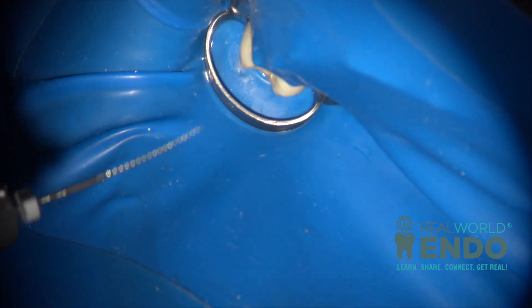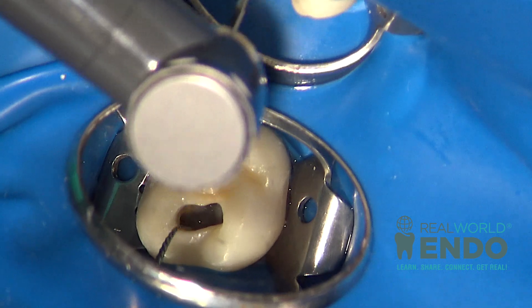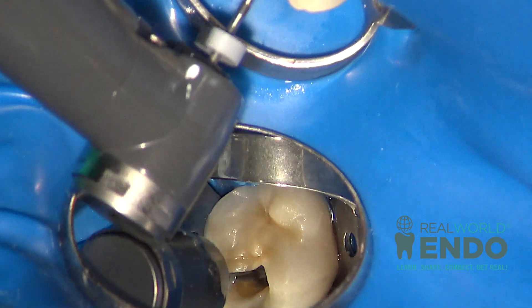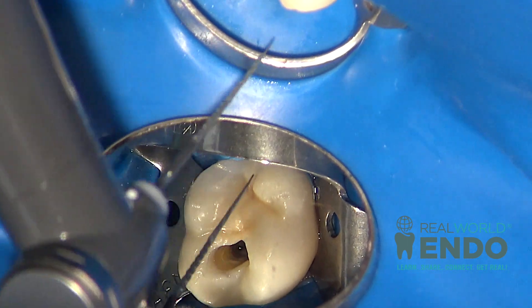The limitation is because of the heat present in your hand as you're doing it, or even the room temperature. But if you actually take an alcohol gauze and bend the file with it, as the alcohol evaporates from the surface it chills and cools the file very quickly. That cooling effect enhances the martensitic properties of the material, and therefore you get more pre-bending using the alcohol gauze than you would with the back of the mirror or your fingers.